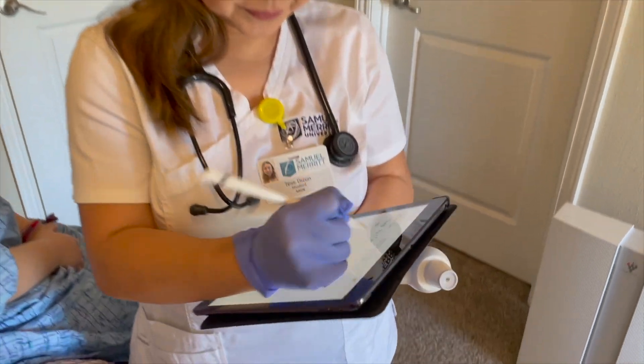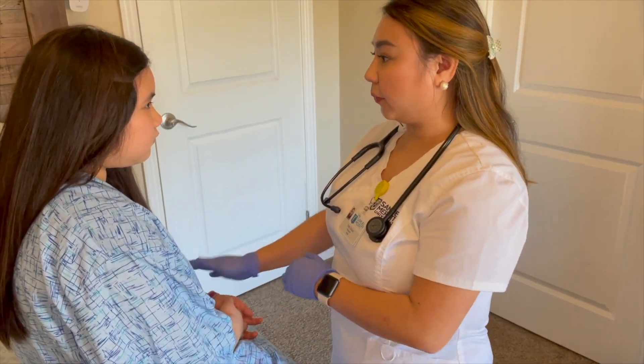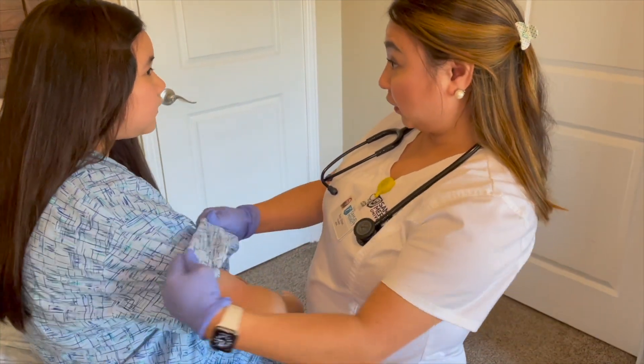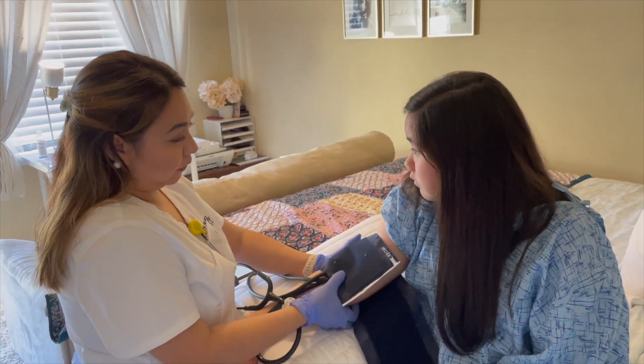You're feeling feverish — which arm do you prefer? Is it okay if I take your blood pressure? When measuring blood pressure, ensure the patient has been inactive for five minutes.